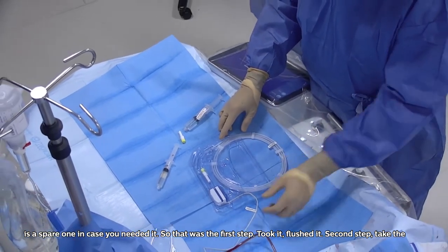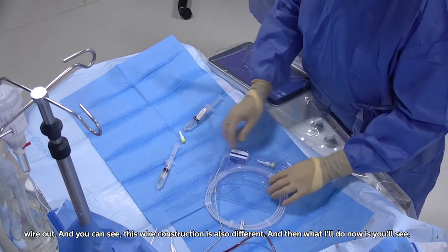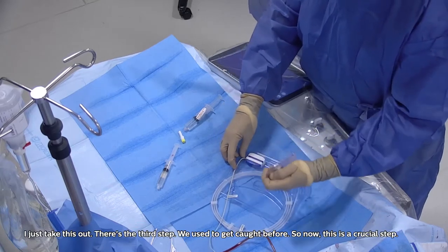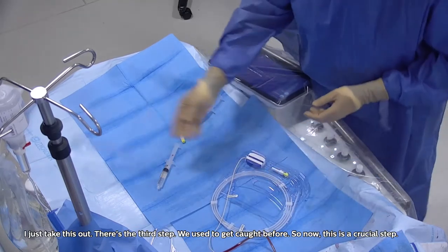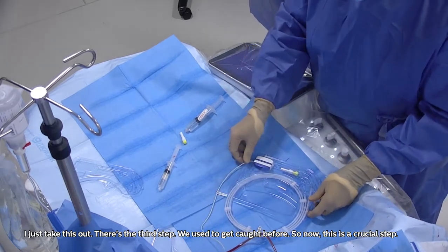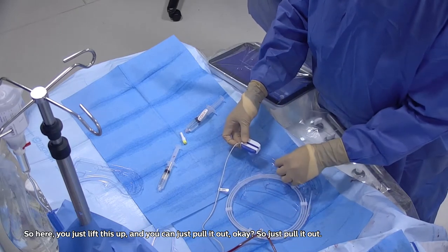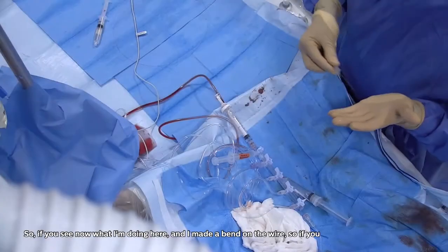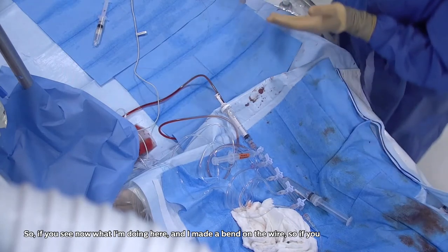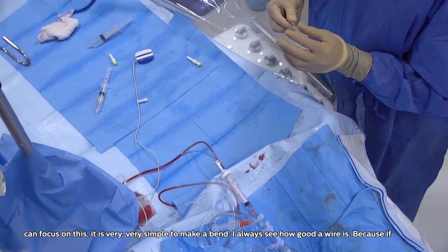Second step, take the wire out. And you can see this wire construction is also different. And then what I'll do now is you'll see, I just take this out. That's the third step. We used to get caught before. So now this is a crucial step. So here, you just lift this up and you can just pull it out. So if you see now what I'm doing here, I made a bend on the wire. If you can focus on this, it is very, very simple to make a bend.